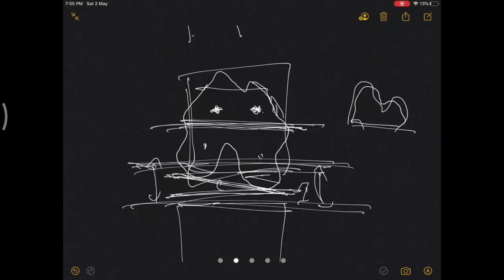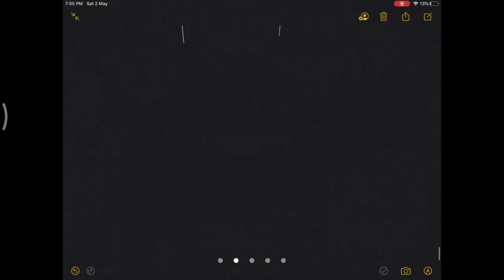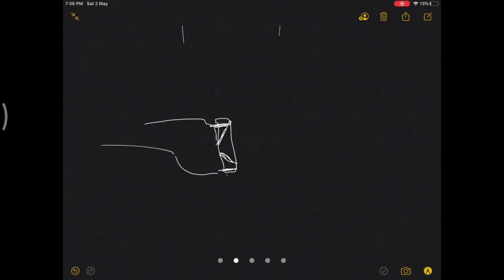Okay, and some people, what they do is they just want to confirm it, and make sure that the flexion gap is balanced. So before taking a cut, you have a box cut like this with a saw capture here, here for chamfer cuts, and you have a cut here, the 4-in-1 block, and you have a distal femur which is cut. Okay, and you have a tibia. And what they do is, before cutting this one, just maybe like this, you will have to cut. No?